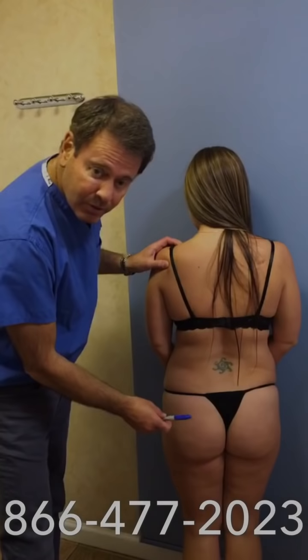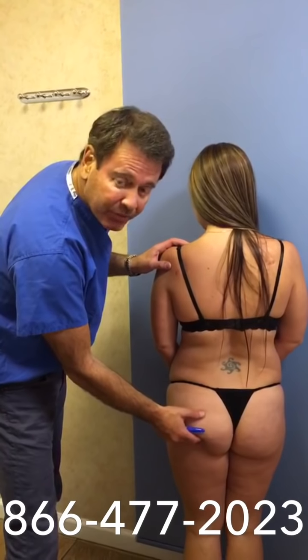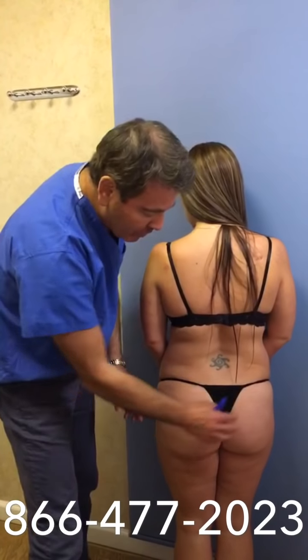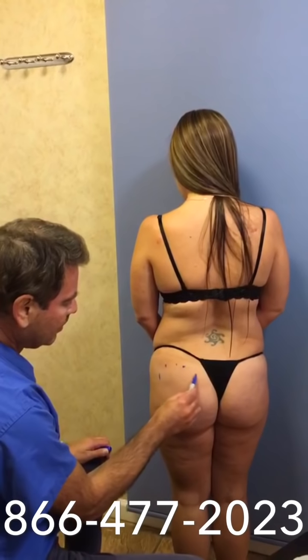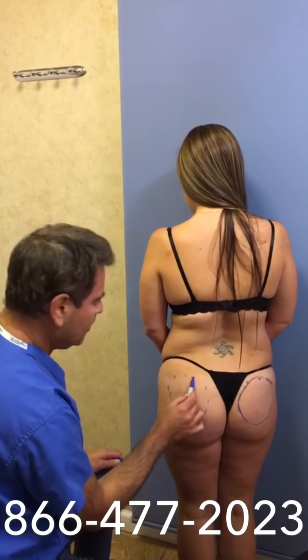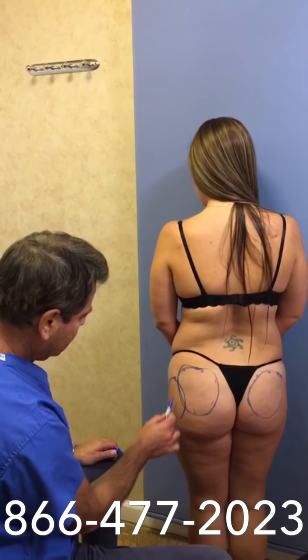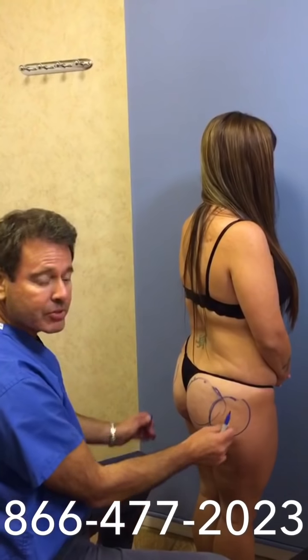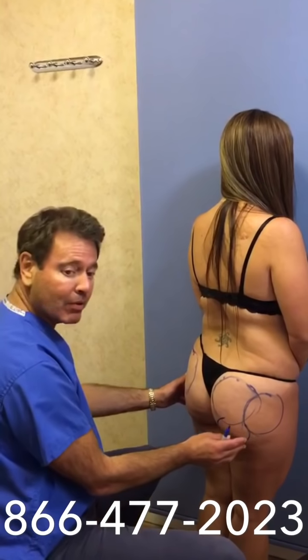I'm going to demonstrate how the procedure works. We're going to enhance the part of the butt that comes down from the lower back to make it wider, higher, and give it a bit of a lift — on both sides. Most women have a little deficiency of the area of the butt on the side where the hip is, so we're going to fill that area too. We can also fill the bottom just to round that out.